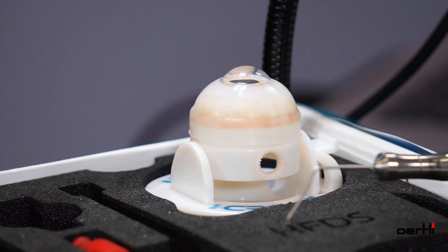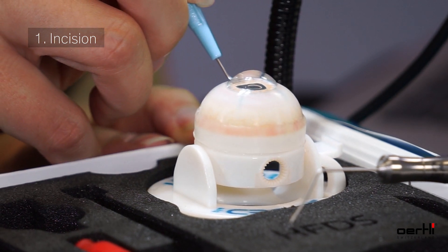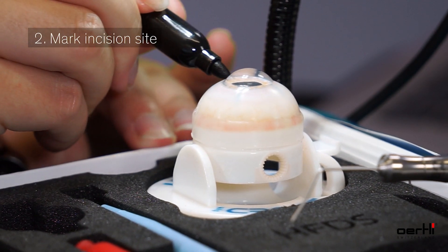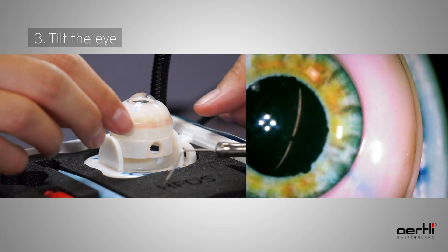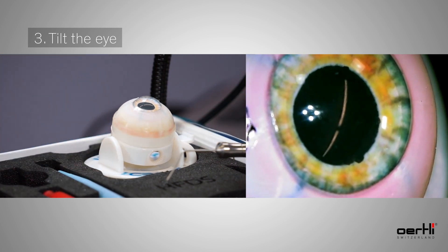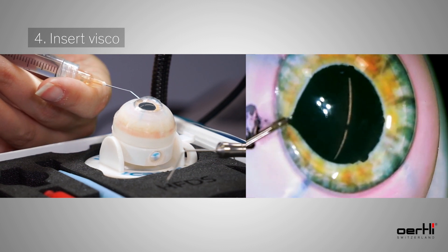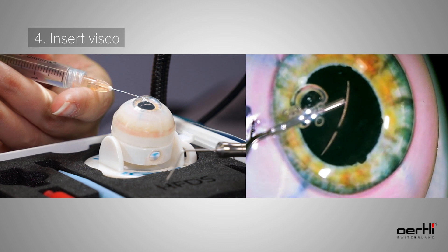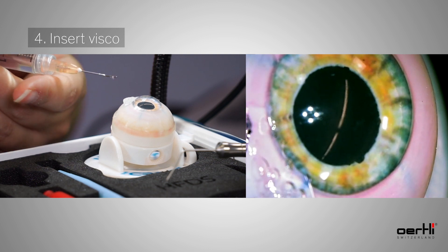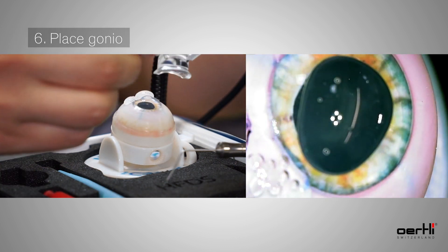Take the incision knife, make an incision and mark the incision site. Tilt the holder with the HFDS eye up to 30 to 35 degrees — the holder enables flexible tilting. In general, insert viscoelastic substance into the anterior chamber. Note that the HFDS eyes are prefilled with viscoelastic substance.